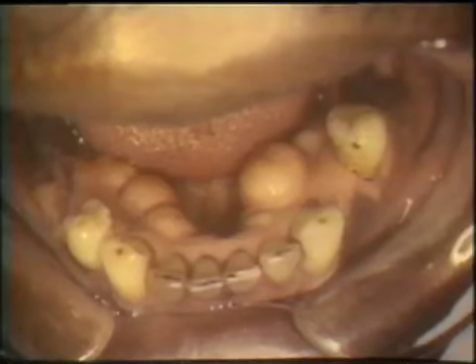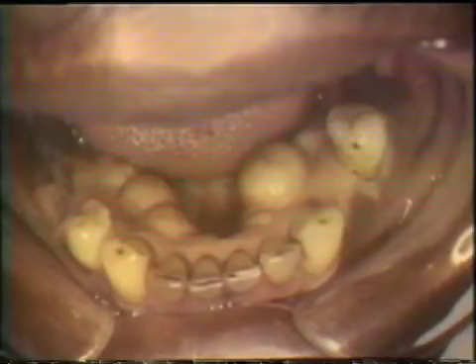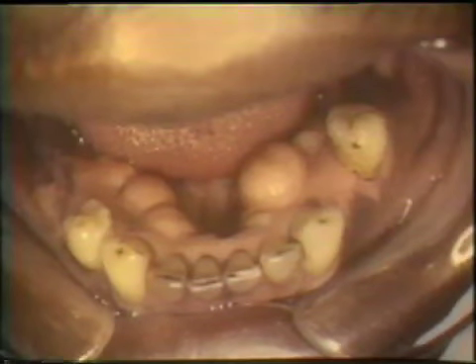Now, these are something to watch out for. However, when they are only of moderate size, an adequate relief space can be made under the lingual bar of the partial denture to allow for movement of the lingual bar without impingement.